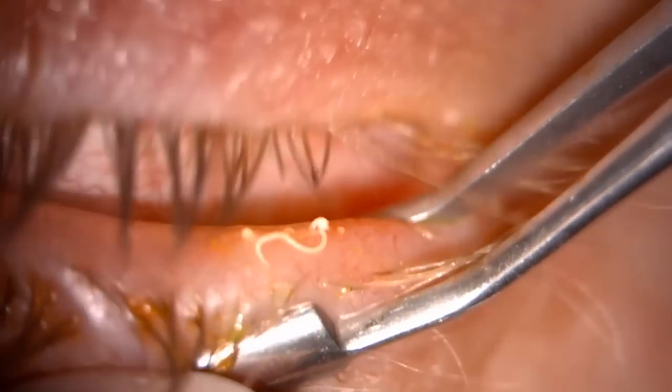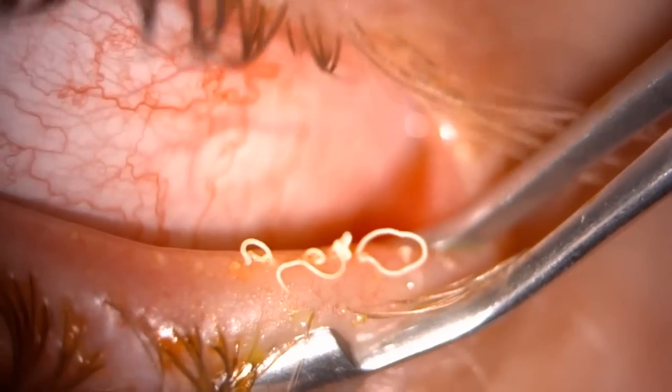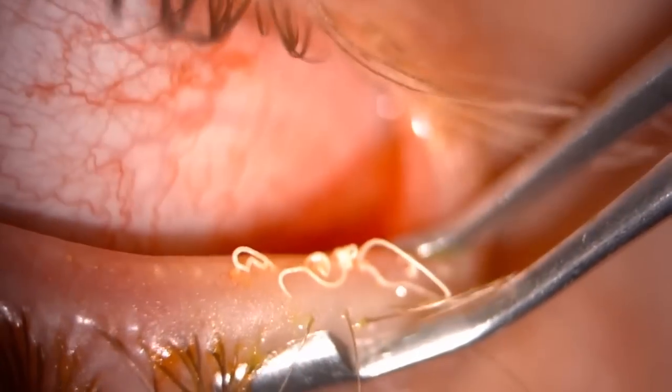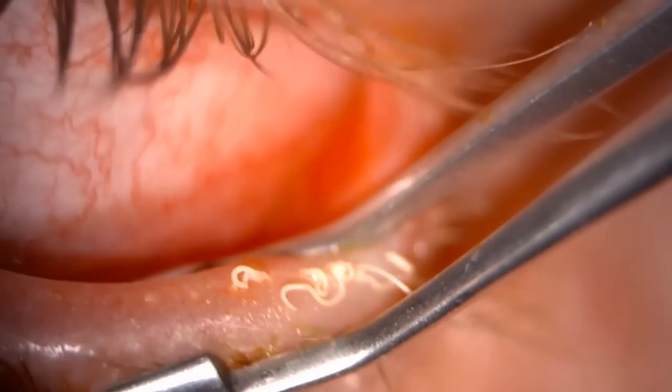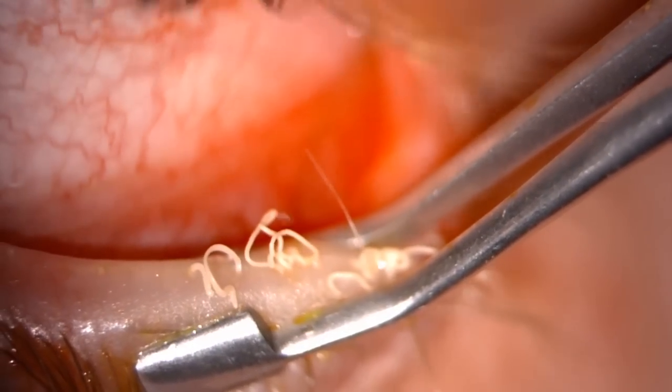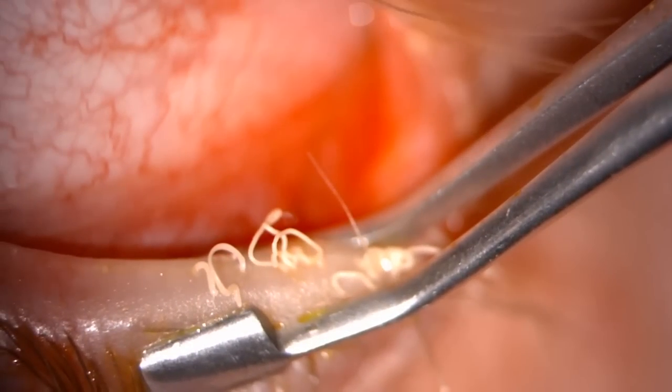Here we have an example of quite a severe blockage with very thick meibum coming out of the glands. You can see that even though it's so thick, with the pressure you can exert with the forceps it does come out quite easily.